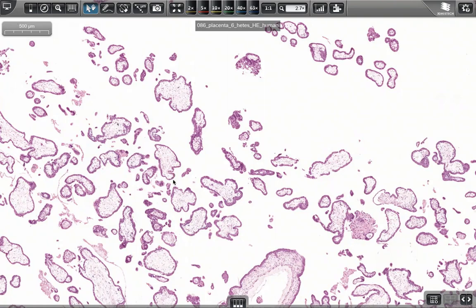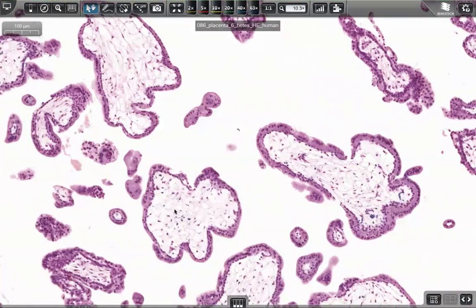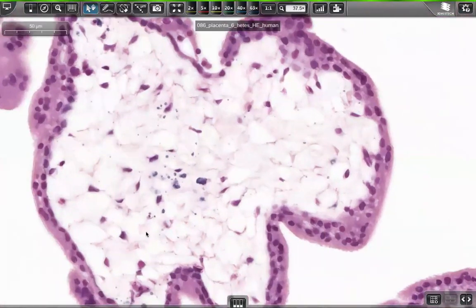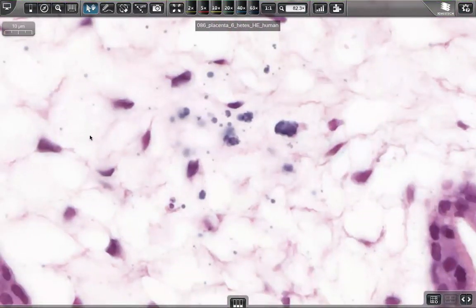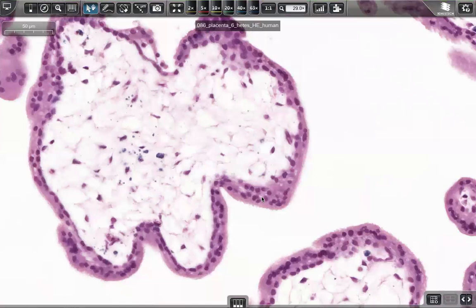Secondary villi, we can see here now, these are the typical appearance of secondary villi. Here the villi represent a mesenchymal core. So there is a mesenchymal core having typical mesenchymal cells. You remember these are sometimes triangular shaped, having long processes. So these are typical mesenchymal cells. So when we have trophoblast cells externally and the core is formed by mesenchymal cells, that is a secondary villus.